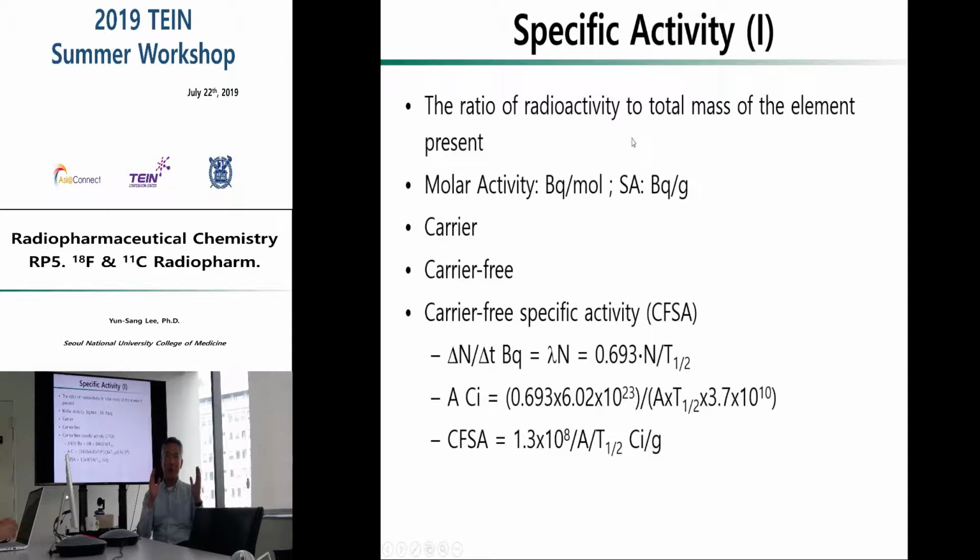The C12 raclopride cannot make a radioactive signal because C12 is a stable isotope. So with more than 99% C12 raclopride and less than 1% C11 raclopride, we can still get the image of the dopamine D2 receptor with PET, because of the extremely high sensitivity of the radioactive detector, such as a PET or any other kind of radioactive detector.